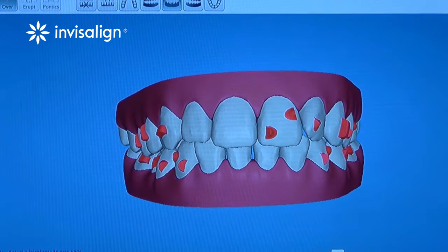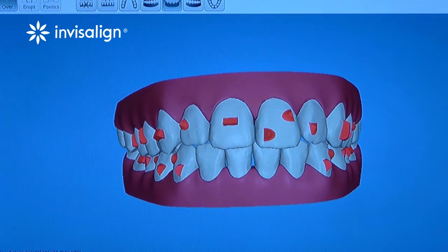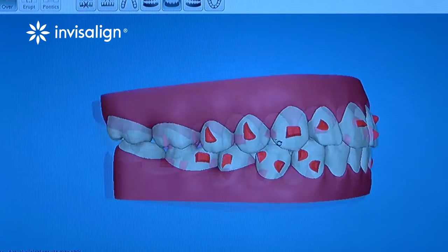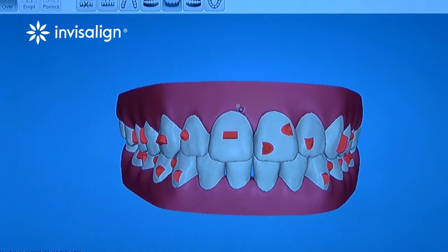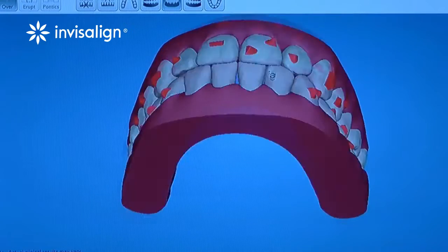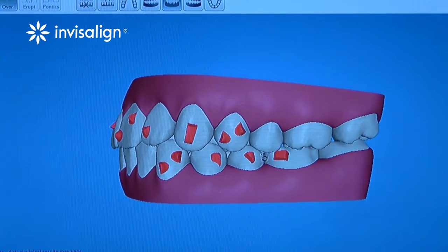You'll see the progression of treatment as well as the end result. And you can see the teeth aligning. The bite is starting to open up if you just look at the front. In the end, if I pan to the side, it'll show you how her teeth fit together, and they fit together beautifully on the side. We can look at it from a frontal view. The midlines are corrected and even, as we like to see. The bite relationship here in the front is perfect. And if we look at the other side, her bite relationship is normal and corrected as well, so everything fits well.